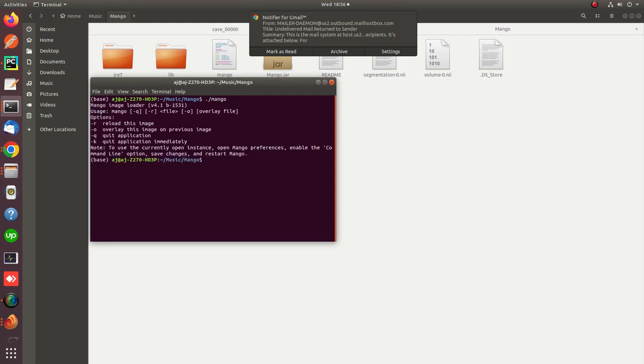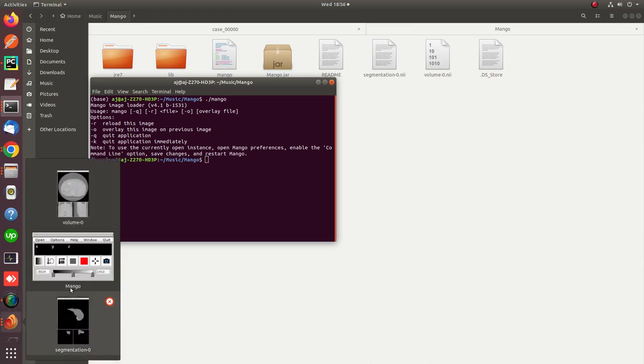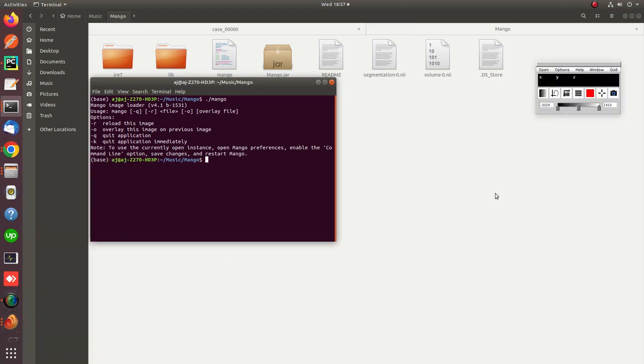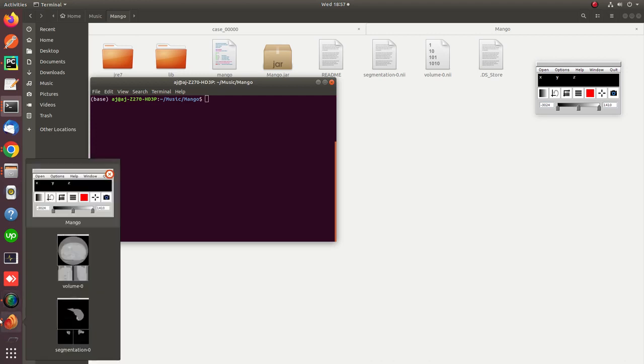It's important for you to understand the image demonstration first, because for creating the algorithm, you must understand the dataset first, what your required task is and how it should look. Thereafter, you can create the algorithm successfully.